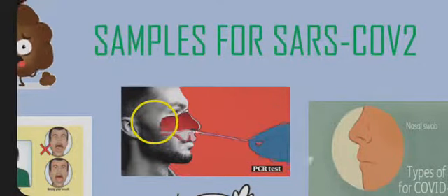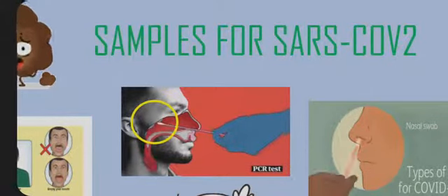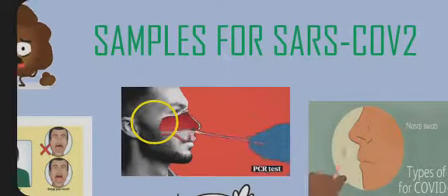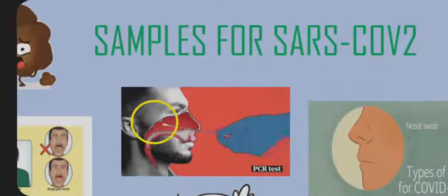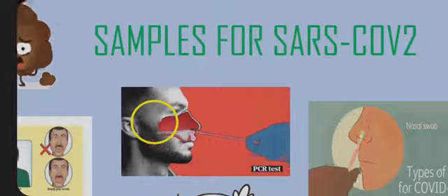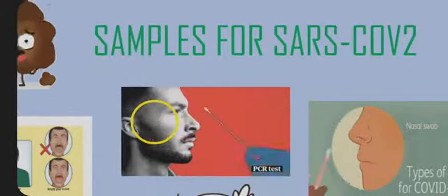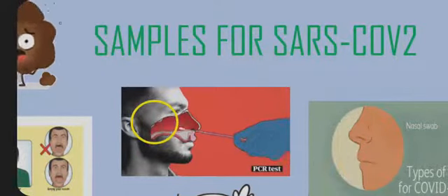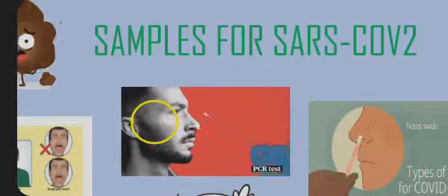In addition to the nasopharyngeal swab, personal protective equipment is used, including a gown, sterile gloves, protective mask, and face shield. Make sure that all sample tubes have been labeled and that the appropriate requisition form has been filled out before starting the procedure. In starting the procedure, insert the swab into the nostril parallel to the palate. If you detect resistance to the passage of the swab, back off and try reinserting it at a different angle closer to the floor of the nasal canal.